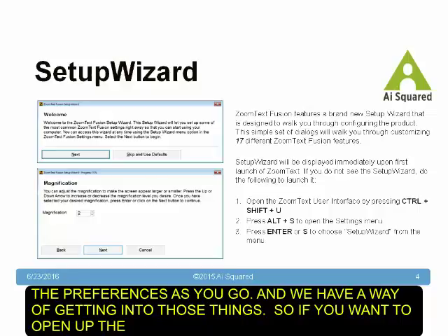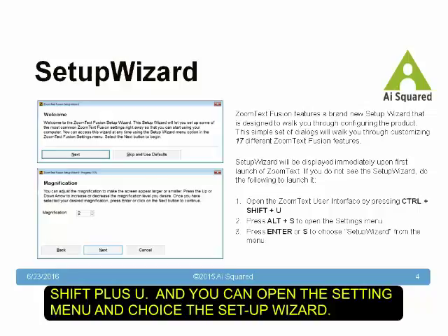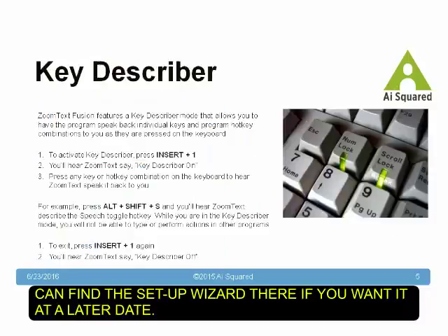If you want to open up the ZoomText user interface, you can use Control plus Shift plus U, then press Alt plus S to open the settings menu, and then press Enter or S to choose the setup wizard. Basically that's saying that on the control panel, which was the previous image, if you go into the settings menu, you can find the setup wizard there if you want to do it at a later date.